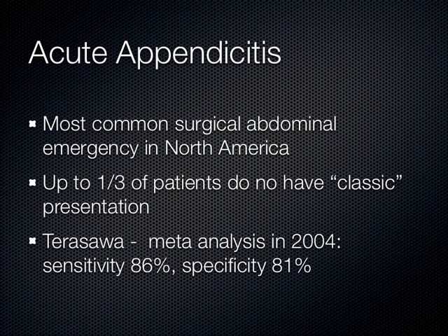Now, going forward, I think ultrasound in the hands of the clinician, the person that's actually evaluating the patient at the bedside and knows exactly where the patient's got the pain, will be better. Sometimes I even hand the probe to the patient. I go, okay, put this where the pain is. And the patient sticks it right where it hurts, and then I push down there, and oh, hey, there's the appendix. The patient found it for me. I think once we see that data start to get out there, the test characteristics will improve. In fact, in other countries where ultrasound is much more accepted in the hands of the clinician, we see incredibly high rates of accuracy with ultrasound for appendicitis.